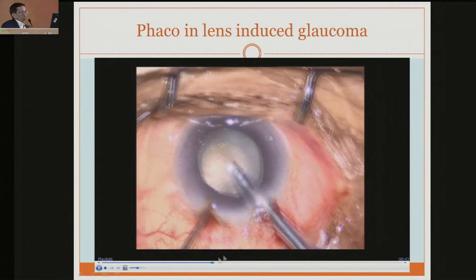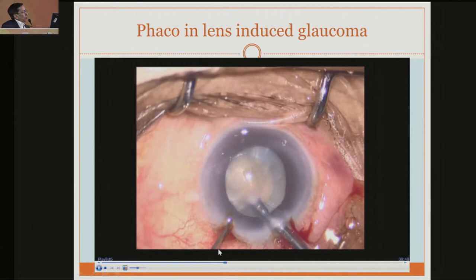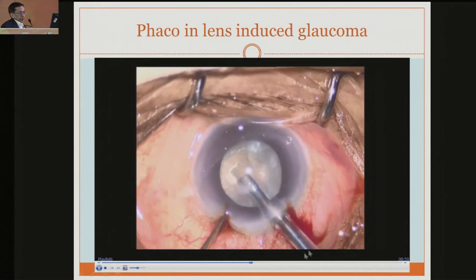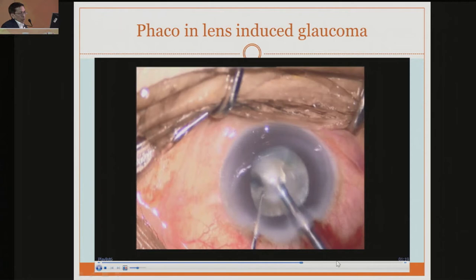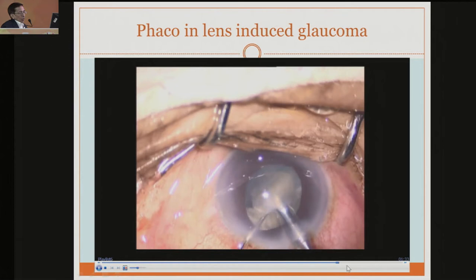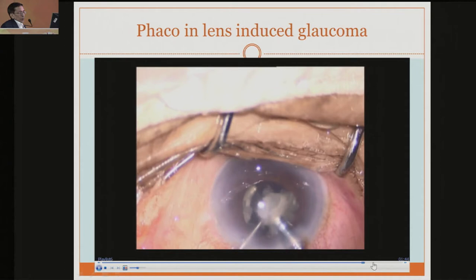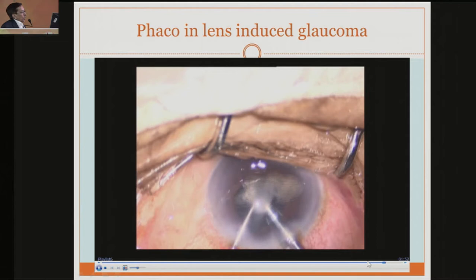You can see in this case that repeatedly the chamber is becoming shallow. We are using good viscoelastic - Viscoat especially is much help because it doesn't come out. You can notice that the pupil is always coming forward; just remove the probe and there is a fluctuating pupil. It is not because it is not well dilated - it is well dilated - but because of the shallow chamber and posterior pressure it is fluctuating. So gentle maneuvers are necessary. With repeated viscoelastic injection, assess that there is no extra external pressure from outside.